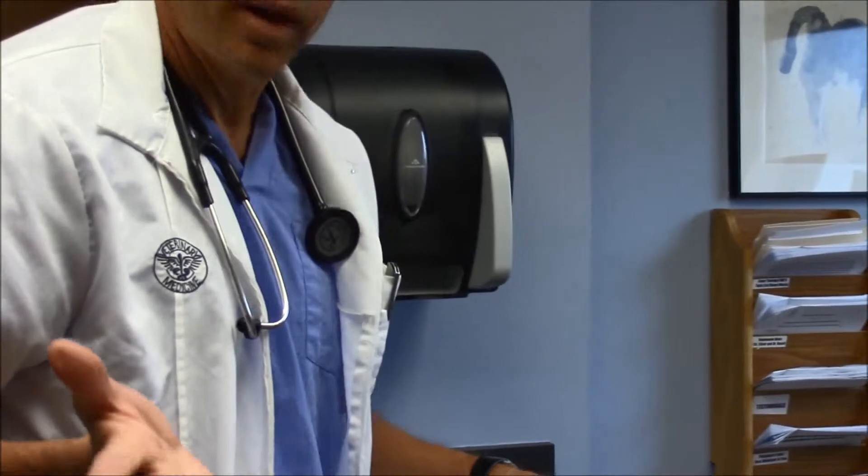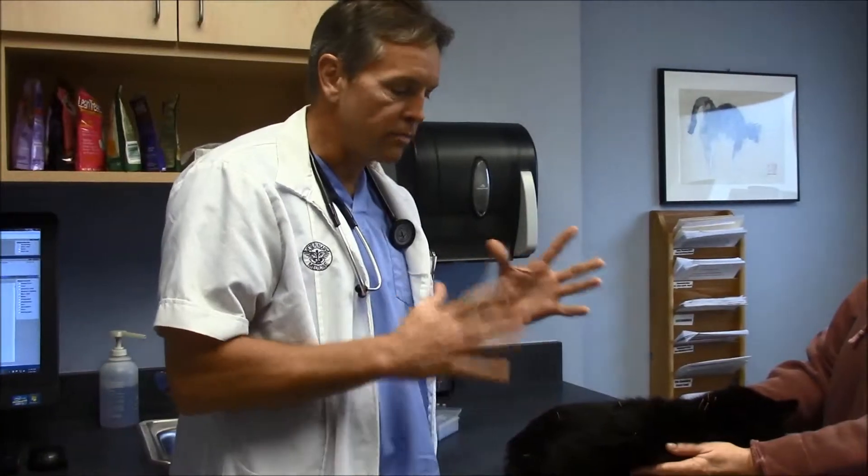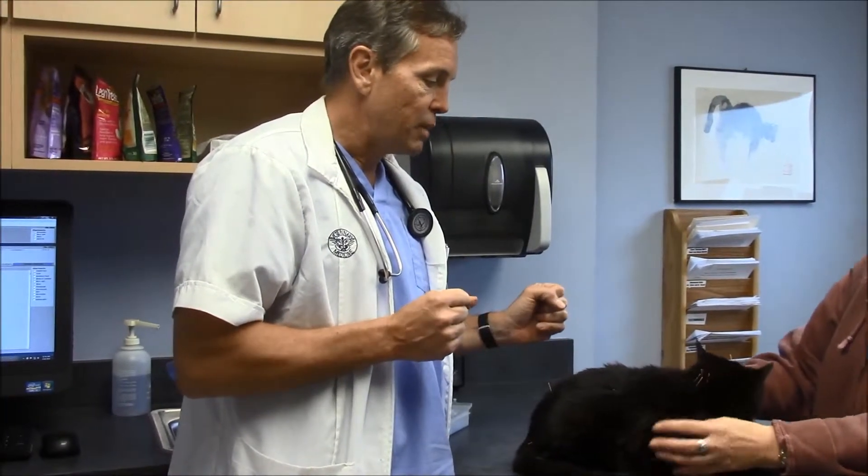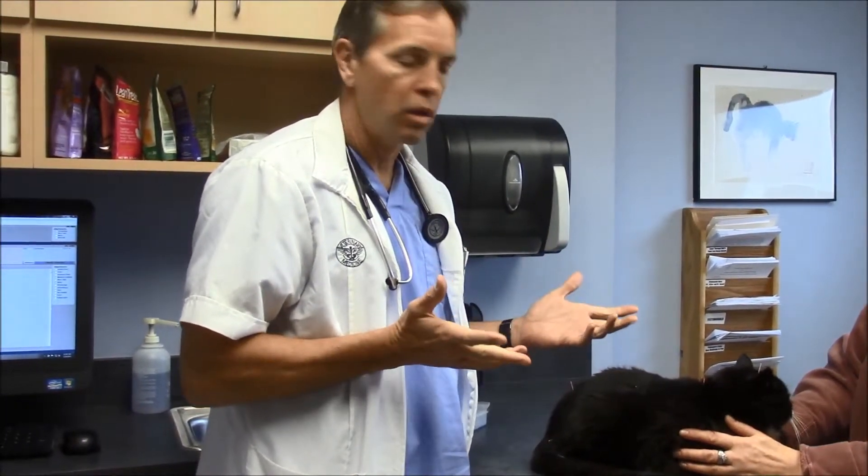So that's the acupuncture treatment. It's a variable time that we leave them in, but in her case we'll leave those in for 10 minutes and she'll snuggle up in her carrier. We'll pull the needles and she'll get to go home.